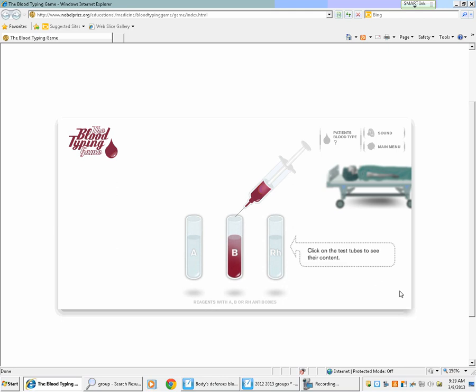Write your hypothesis first. Go ahead and write your hypothesis, doctor. No, just test tube B. We haven't done all of them yet. No. What should the hypothesis be saying, though? Not what yours says. What information should it be giving? His blood type is type A. Don't give me specifics. It should answer the question, which is what? What's the patient's blood type?